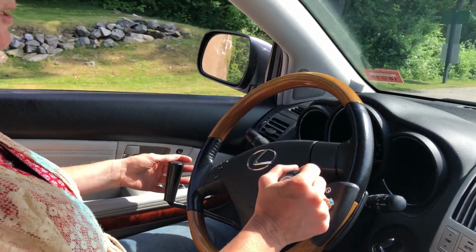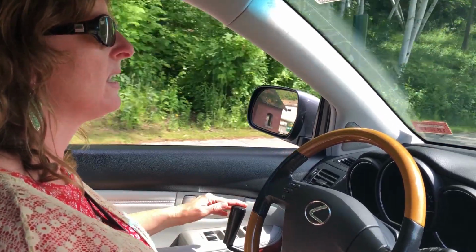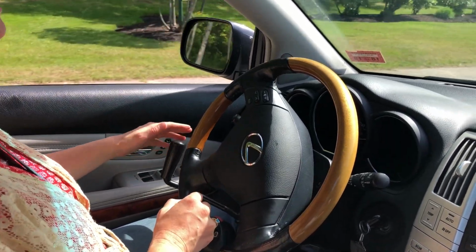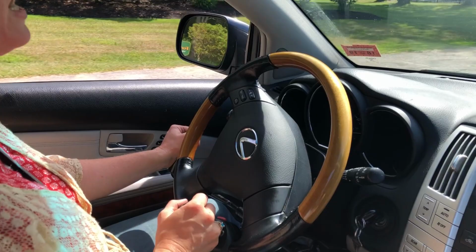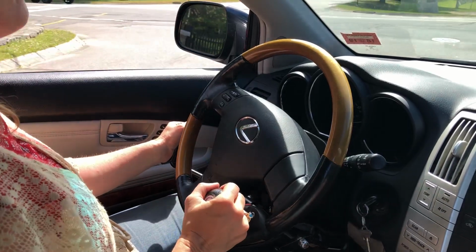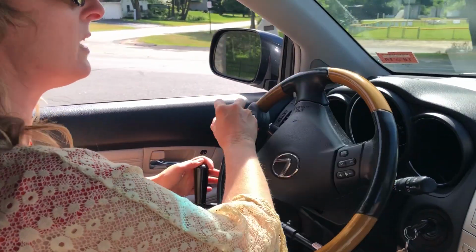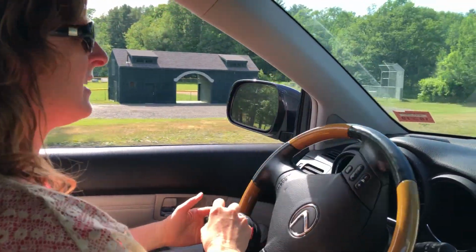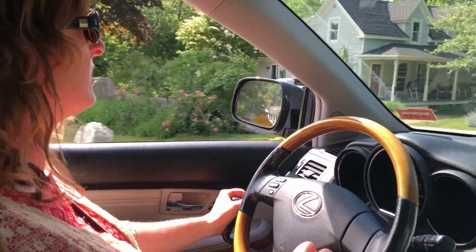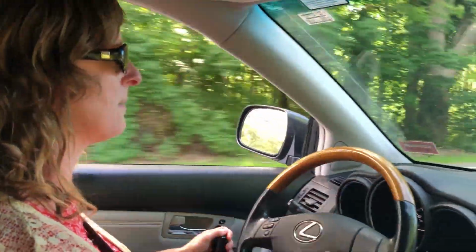But more people prefer the push rock style like this, because you can rest your elbow, you can use your fingers, you can use the weight of your hand. You've got more options for your hand for controlling the gas, which is really nice, because when you're driving with hand controls, it's nice to have some different options, because it helps with the fatigue in your arms. But after people get used to it, there's pros with the adaptive equipment.